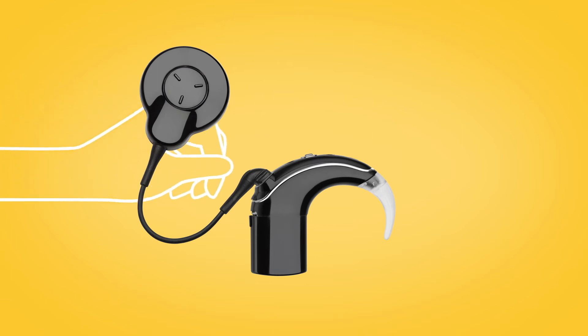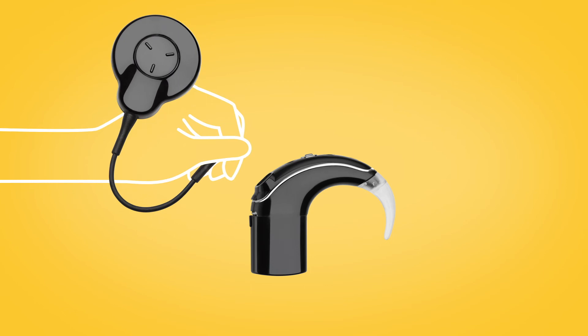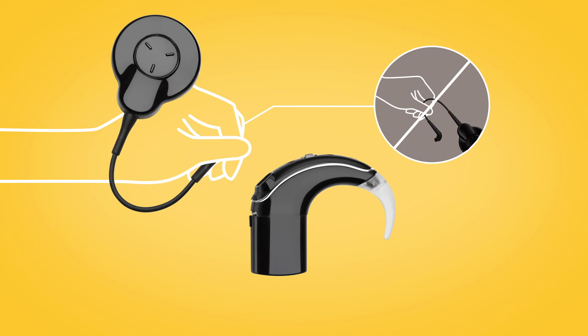Hold the coil cable grip and firmly pull it straight out of the sound processor. Do not tug on the flexible part of the coil cable, and be careful not to twist the coil cable when you pull it out.